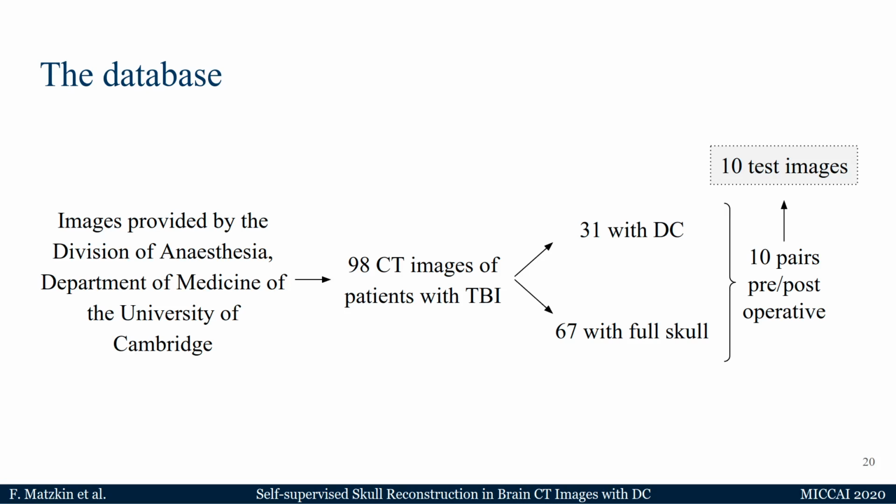For training, we used the remaining full skull images, excluding those images of patients in the test set, which resulted in 52 images in total. Note that since we perform virtual craniectomies, the actual size of the train split is bigger.